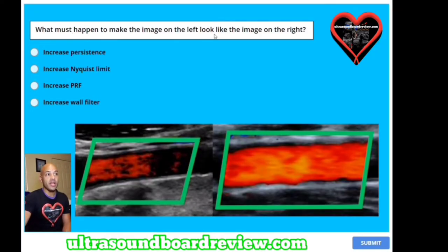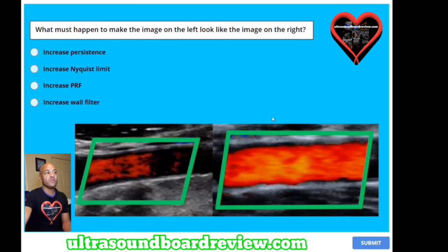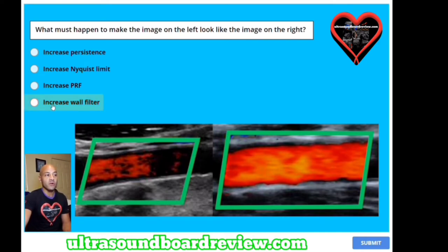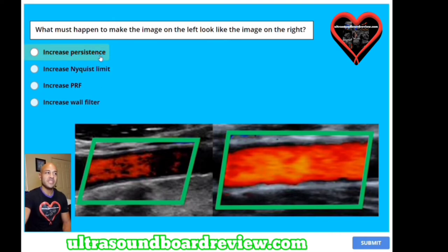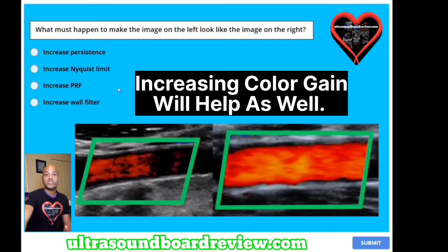What must happen to make the image on the left look like the image on the right? A) increase persistence, B) increase Nyquist limit, C) increase PRF, or D) increase wall filter? Don't get trapped into thinking 'there's PRF, that's got to be the answer' — read carefully because the options say increase. If you chose increase PRF, that would probably completely eliminate all color Doppler in this vessel. Increased Nyquist limit — no. Increase wall filter — no. Increase persistence — yes. Increased persistence will actually fill in the missing color Doppler in this image. Always go with the best option.